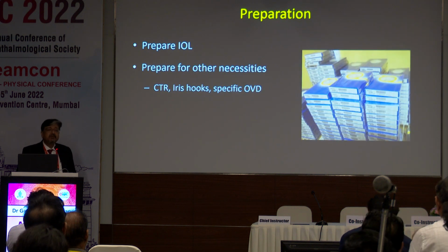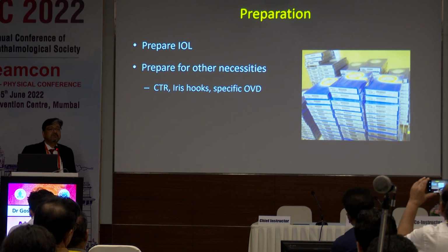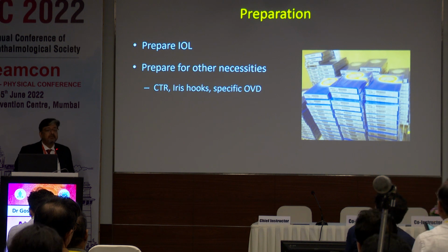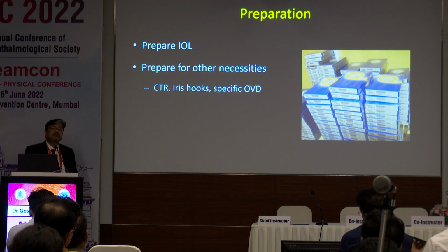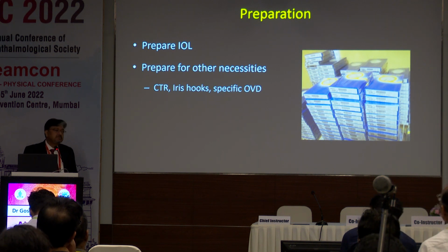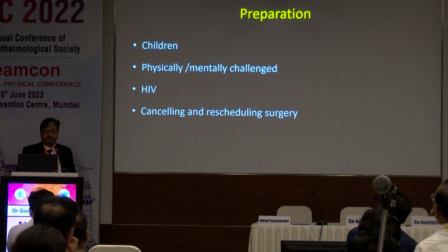Other than preparing the patient, the OT area should also be nicely prepared for the surgeon. For instance, whatever IOL you are implanting, at least those IOLs and a backup IOL should be there. And if the case requires specific changes, like for instance, special viscoelastics, dilators, anything like that, they should be available as per the case requirement.